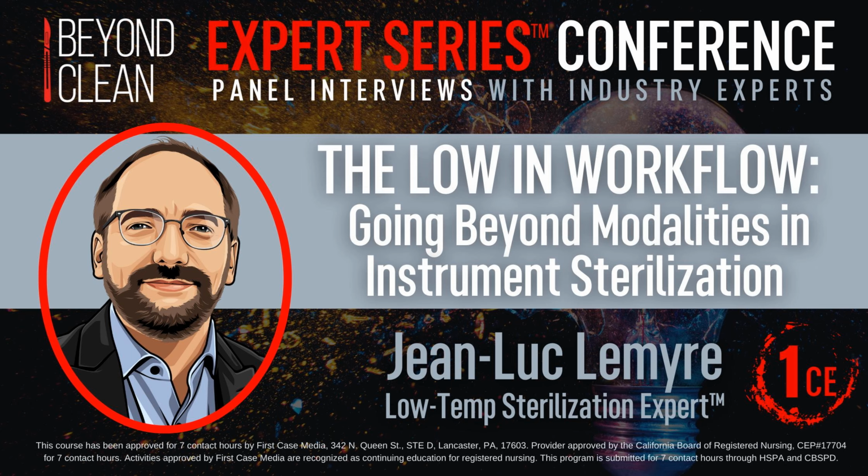Yeah, again, making sure that the implant sterilization is covered by the claim of the sterilizer. I'm not sure about all of the low temp out there. If I think about our own system, it's not validated for implants, so it should not go in there. Gotcha. So, absolutely important, especially if switching from steam to a low temp and there's an implant in there, the user has got to be aware that it may not be validated for it.